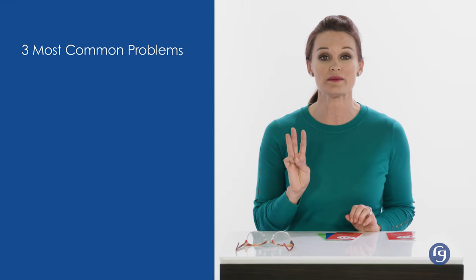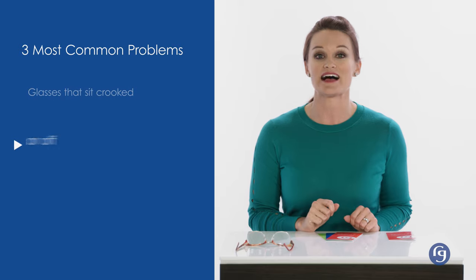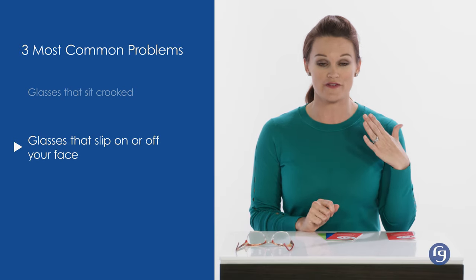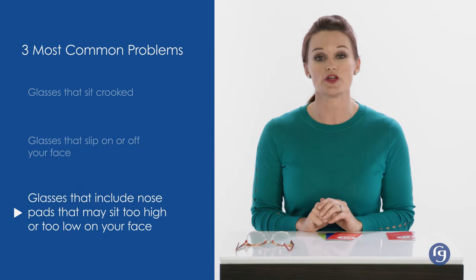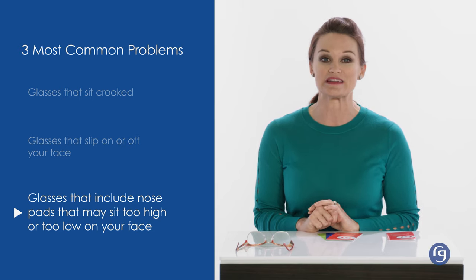Our demo today will focus on the adjustments to correct the three most common problems: glasses that sit crooked, glasses that slip on or off your face, and glasses that include nose pads that may sit too high or too low on your face or don't completely conform perfectly to your nose.